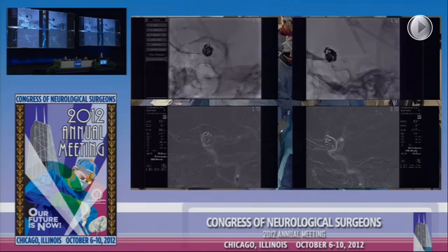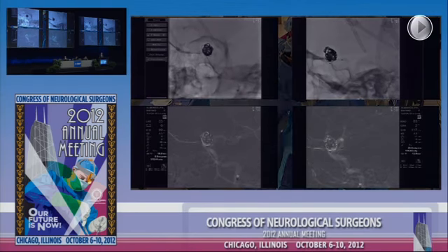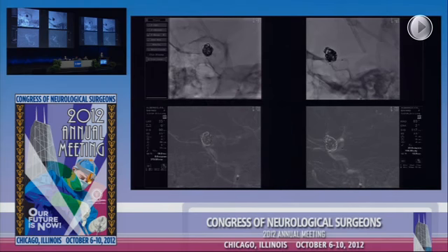So he's across the aneurysm now. He's anchored in the PCOM, so we're going to pull that wire back on the lateral. And he's going to try to twist out of the PCOM. Just pull the wire a hair back. There you go. Okay, MCA. You're fine. Keep going. So if you look on the AP, he's now going across the MCA bifurcation.